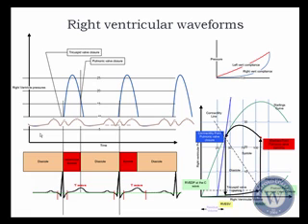Next point is to show you how this waveform, that's your CVP, lives underneath this. The CVP waveform is generated, to a certain degree, by what the right atrium is creating, but it's also affected by the actual filling pressures reached inside the right ventricle. So right here at the C point, that's why it overlaps directly and gives you the most accurate measurement of right ventricular end diastolic volume by using this right ventricular end diastolic pressure, which we call CVP. So CVP should be monitored here, right in this red line.